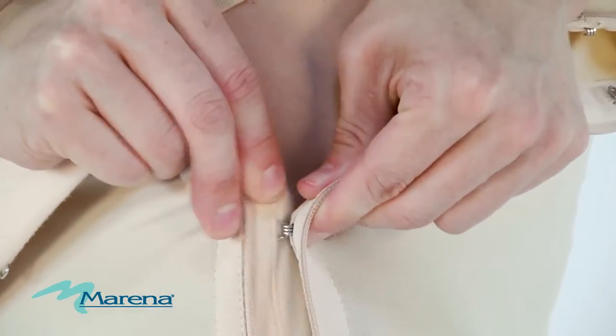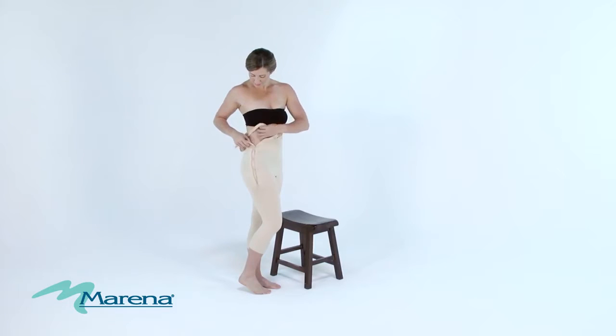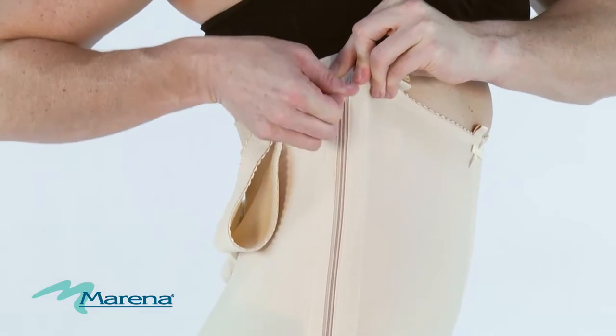When pulling to close the hooks and eyes, be sure to use your fingertips, not your nails. Once the hooks and eyes are completely closed, you're ready to zip each side of the garment.